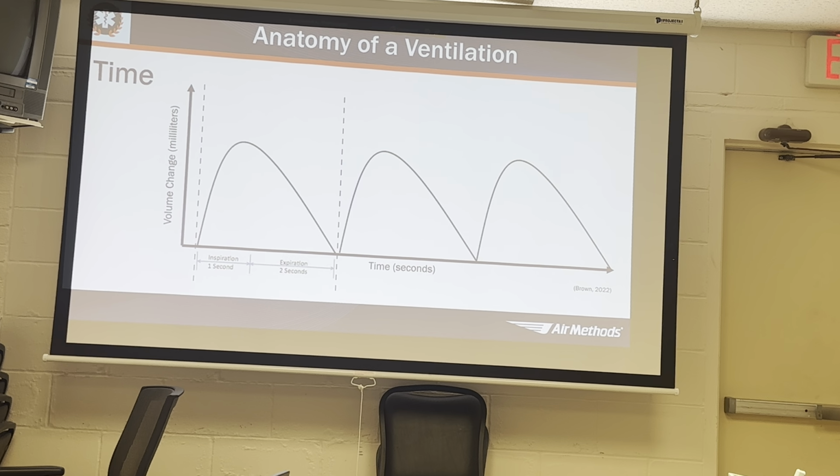There are exceptions to that, like in ARDS, where maybe we're having trouble oxygenating, then we'll flip that just for a period of time, or as a bridge to get on ECMO or whatever. So it really just depends, but this is just to illustrate we should be letting them expire for twice as long as we're making them inspire. Generally one to two.